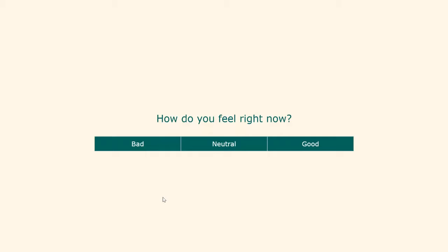The system makes use of short questionnaires to gain some insight into the context during the time of testing. Simple binary and ternary responses are used to ease the cognitive load on the user while still providing valuable information on the user's perceived mood and context.